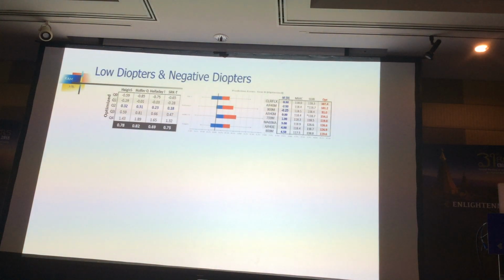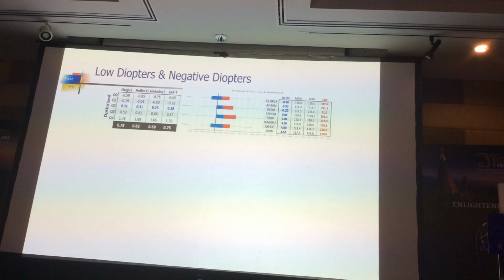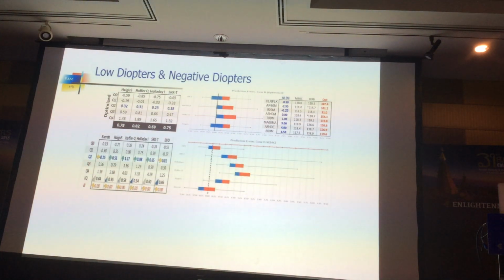And it's very difficult to get the kind of number to optimize. All right, you can get good outcomes with older formulas, but you've got to use a completely different A constant, which is not easily available. So then we use what is recommended by the company.